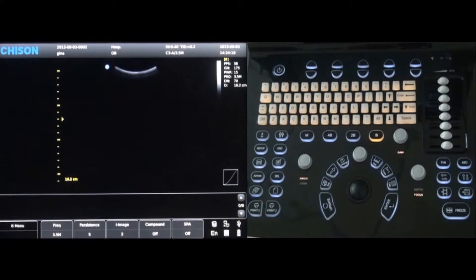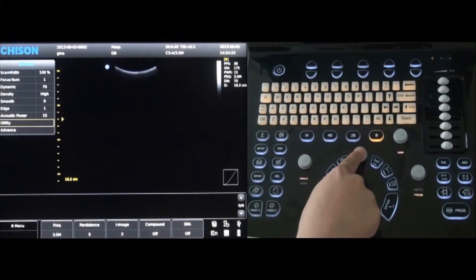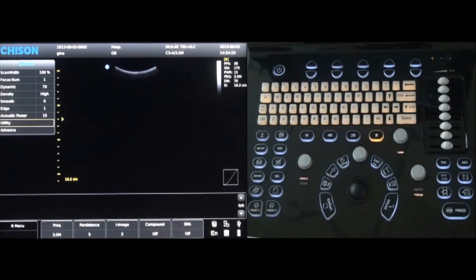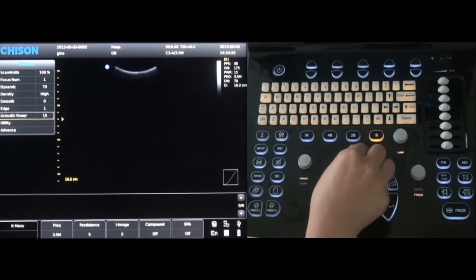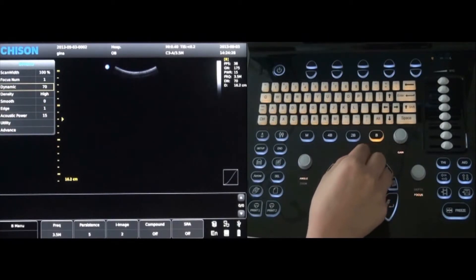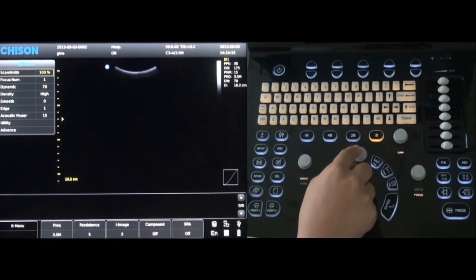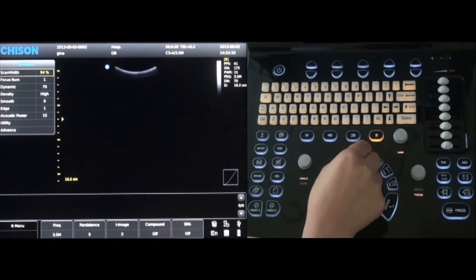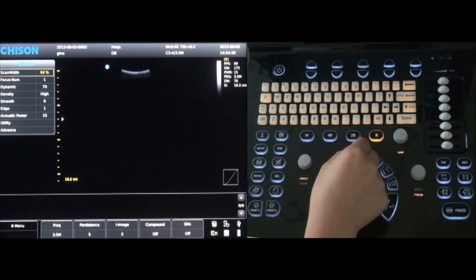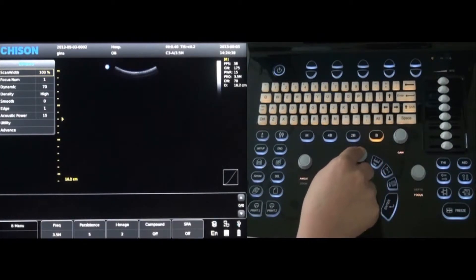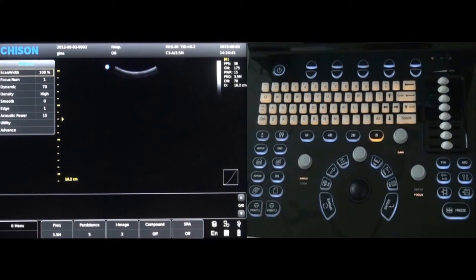Other menus can be turned on by pressing the menu key located above the trackball. Rotate the menu key to choose the scan width control. Press the menu key and rotate it to adjust the width of the scanning area. Press the menu key again when the correct width is selected.